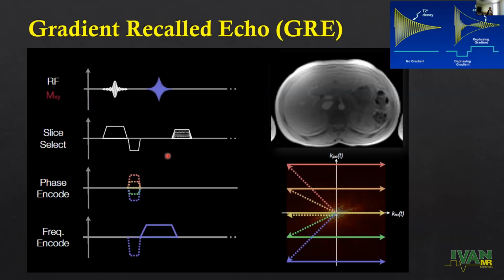Just to give a basic overview, I don't know how much you know about MRI sequences. We use a GRE sequence. I think GRE should be familiar to you, but the only difference for creating an image is that you have gradient localization. So you use a slice select gradient, a phase encoding gradient, and a frequency encoding gradient, and you fill each line in K-space.